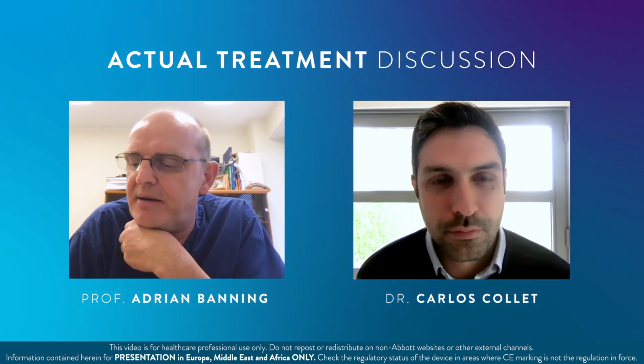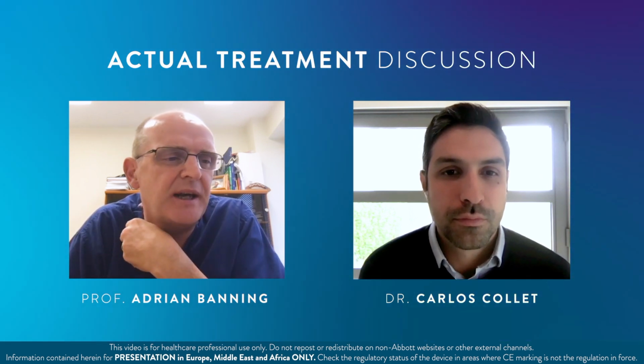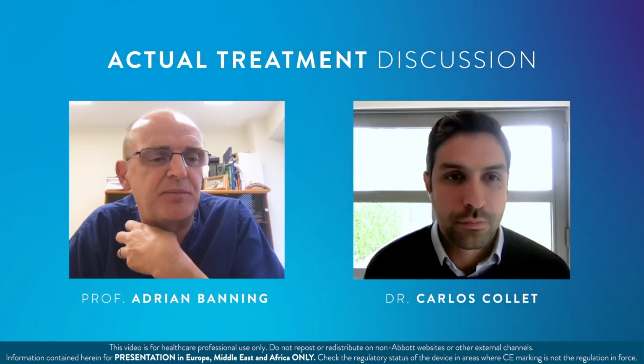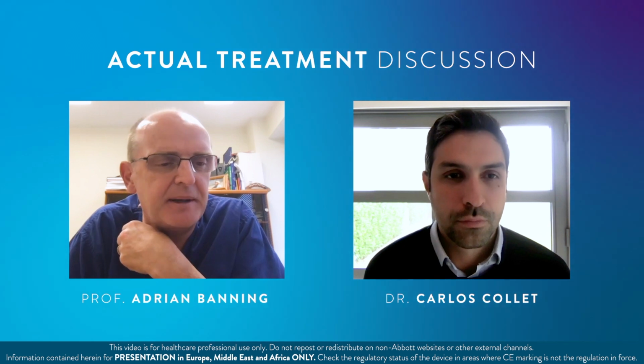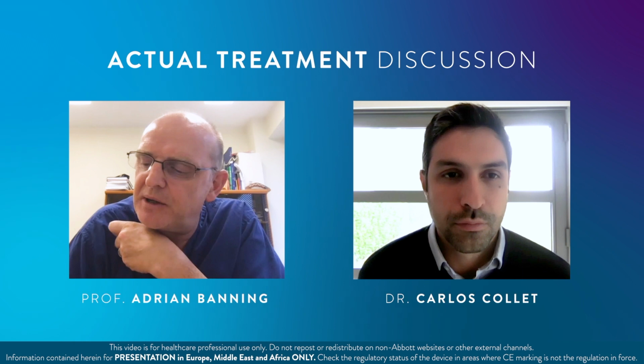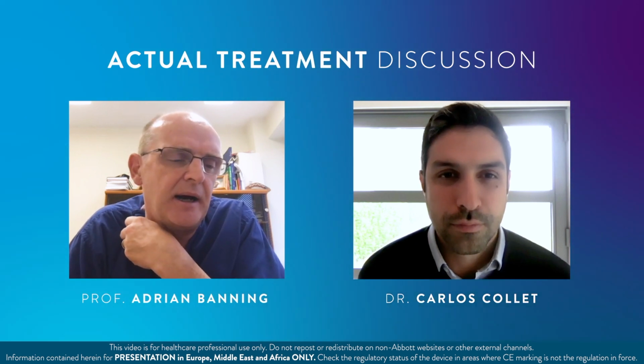That has a bearing on my approach here, that I might not be looking for angiographic perfection. I want that diagonal to be open, and I want it to be as good as it can be, but I'm not striving for angiographic perfection in the branch. I want to make sure that the main LAD is absolutely optimized. So, Gabor, you have a question for Carlos?